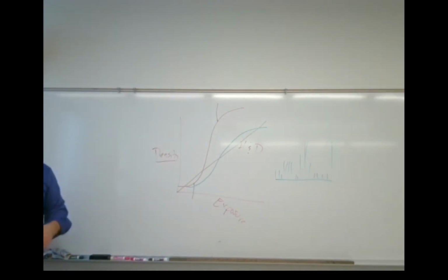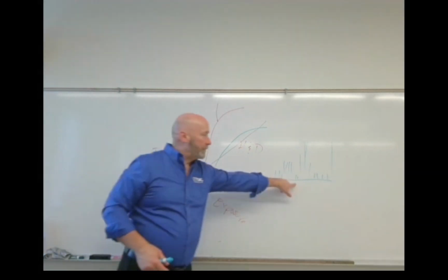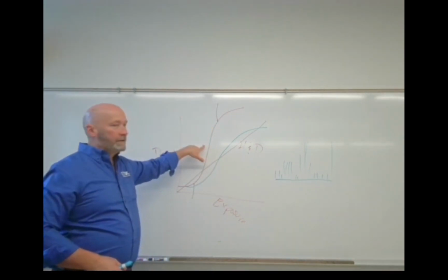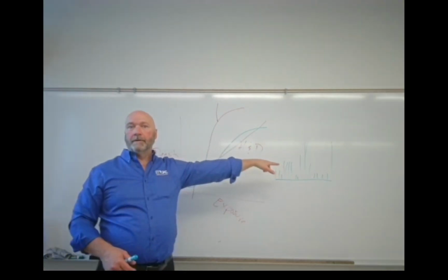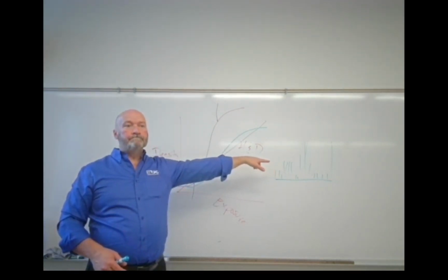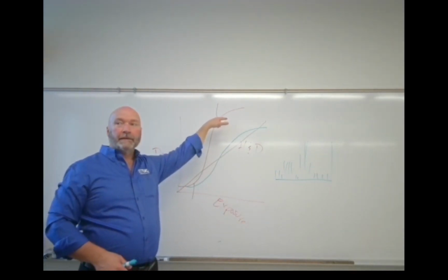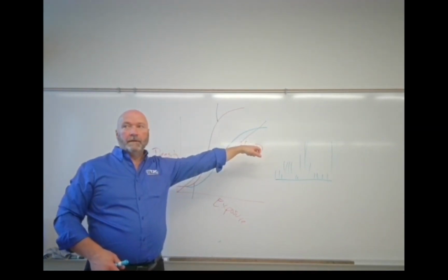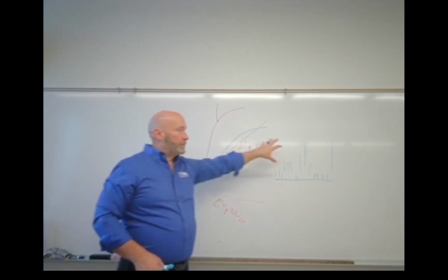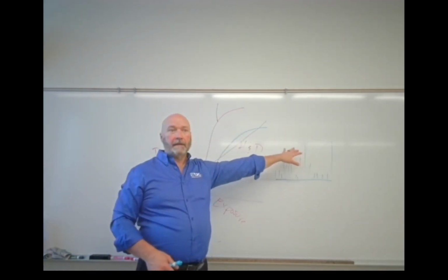It doesn't really mean a whole lot, except if this computer algorithm had this H&D curve next to it, what could you say about that algorithm? It ran off of a slow receptor. This one ran off of a fast, high-speed, high-contrast image receptor. Okay? So this would associate with things like hand x-rays, extremity work, things like that.